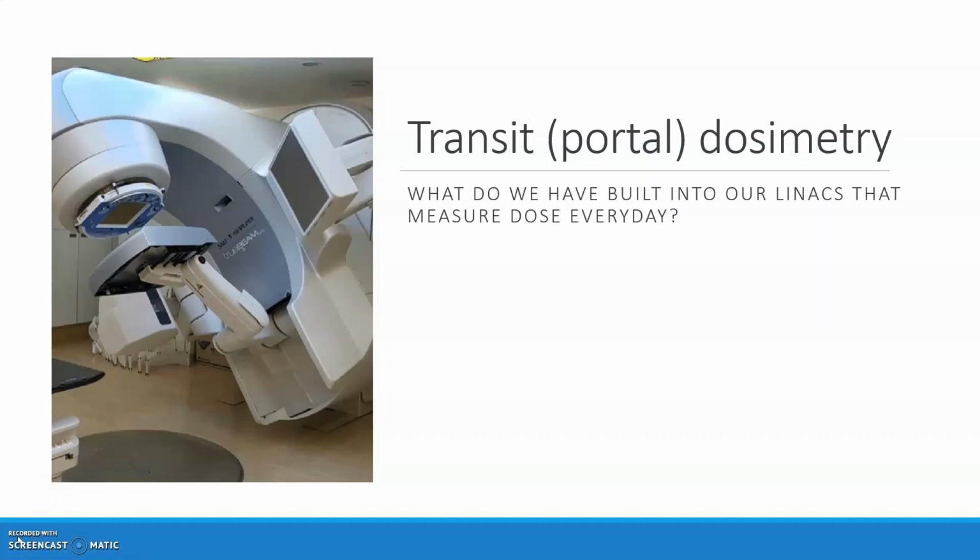So remember so far, point dose measurements with diodes, great. Okay, can be really useful for simple techniques. It's got some problems, but it can give us confidence in what we're doing with these more straightforward techniques. With many of the techniques that we use now, with IMRT, Sabre and so on, if we want to verify the dose that we deliver, then we can't use diodes. We have to use some sort of transit or portal dosimetry. So let's explore that in a bit more detail.